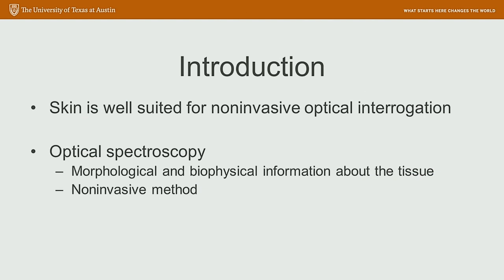As everybody knows, skin is well suited for non-invasive optical interrogation, since it's very easy to access. Optical spectroscopy is one way to do this, and it can give you morphological and biophysical information about the tissue, as well as being a non-invasive method.